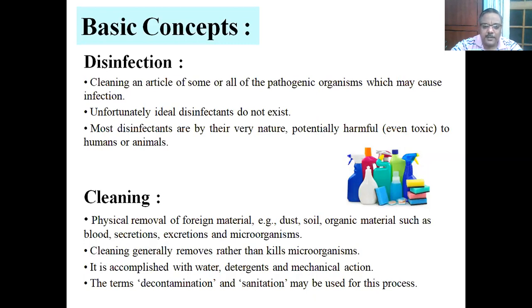Whatever disinfectants are in the market, we will be seeing the labels 99% or 99.9% effective. But we have not seen any disinfectant which claims it to be 100%. And unfortunately, most of the disinfectants are by their nature potentially harmful and even toxic to humans and animals.